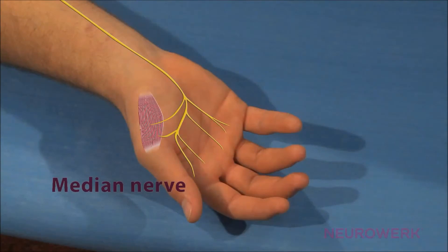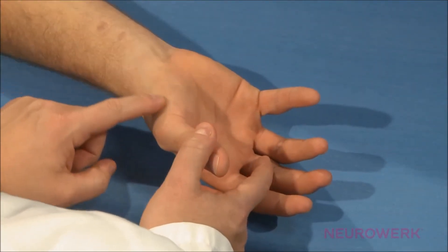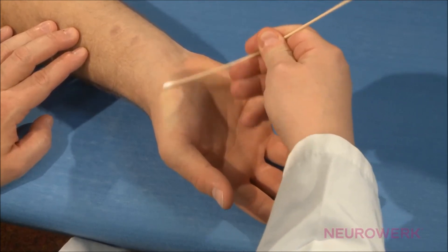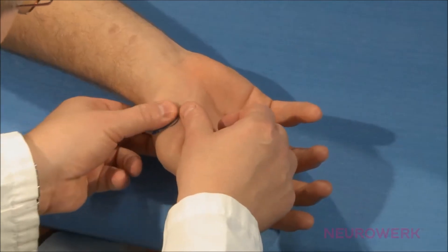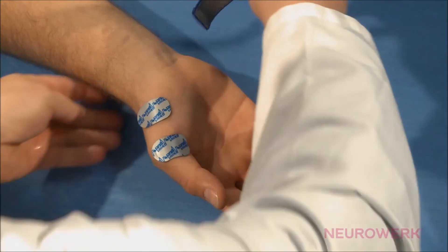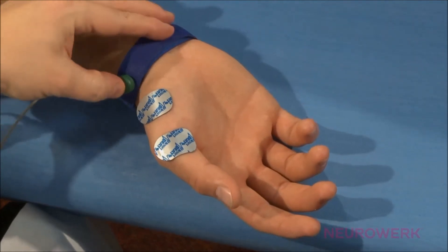The active or differential electrode is placed precisely above the muscle belly of the abductor pollicis brevis muscle. The electrode position is determined by abducting the thumb maximally. The indifferent or reference electrode is attached to the front thumb joint. The electrodes can be secured more effectively if the skin is degreased prior to application. The ground electrode is fixed proximally from the recording electrodes and should always be moistened and fastened tightly.